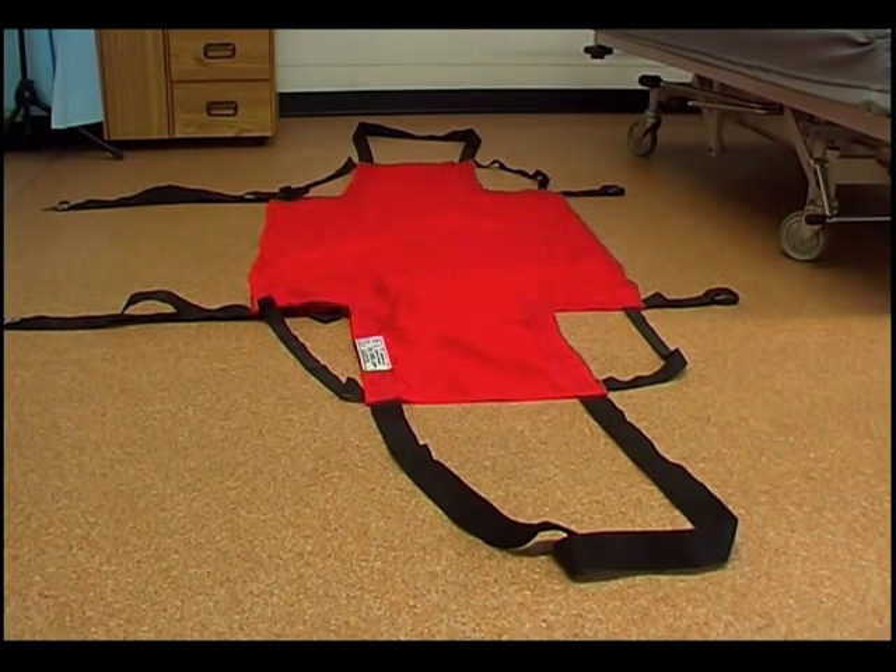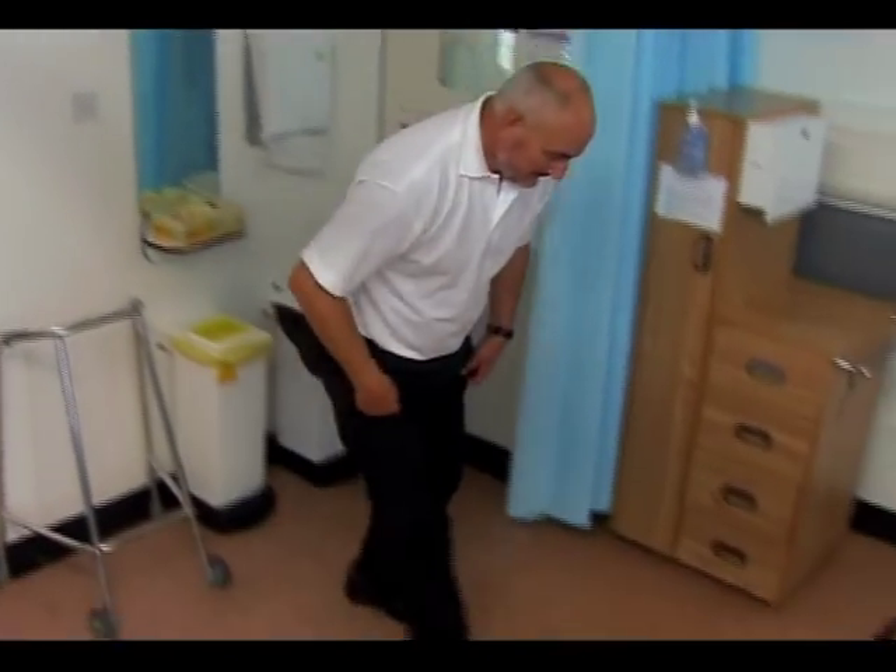As a very rough rule of thumb, the manufacturers recommend that the combined weight of the staff pulling the ski sheet should not be less than that of the patient or resident.